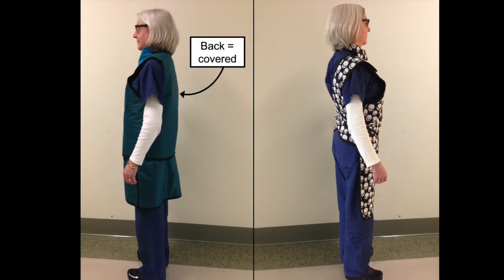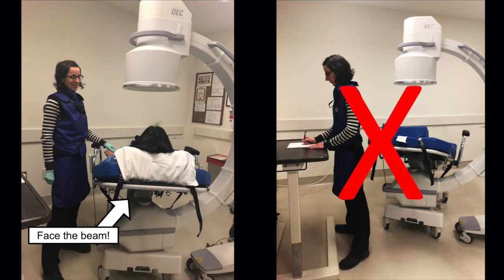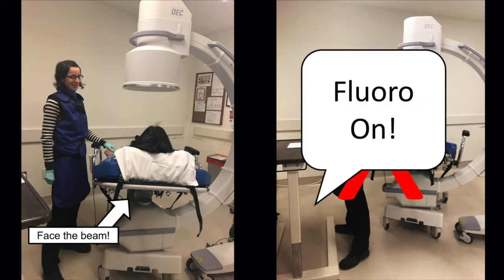You can see the lead vest and skirt combination protect both the front and the back of the wearer. However, the apron leaves the back unprotected. So anyone wearing an apron must face the X-ray source when the beam is on. To ensure that this happens, be sure to instruct all unfamiliar staff prior to the procedure to face the beam, and remember to loudly announce "Fluoro on" when you hit the pedal.